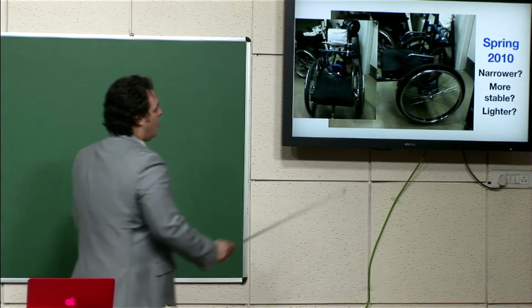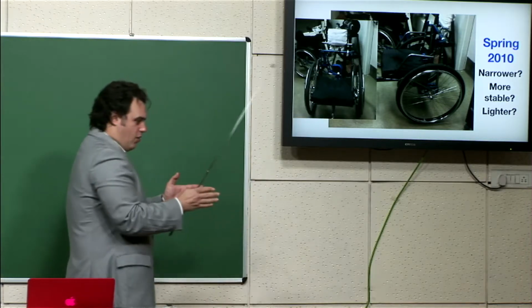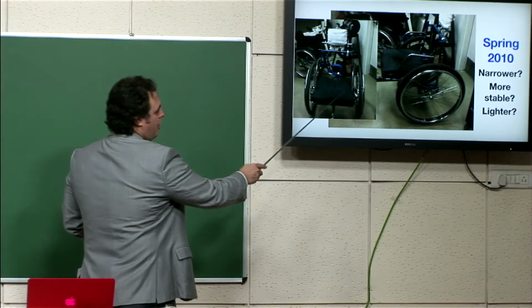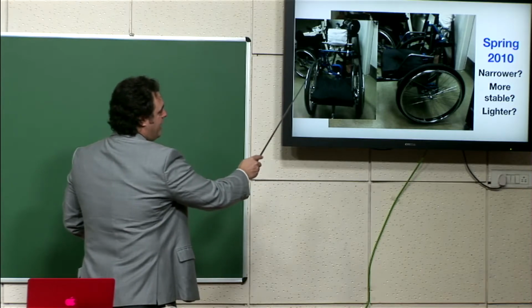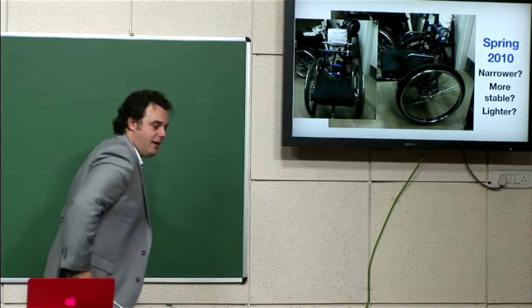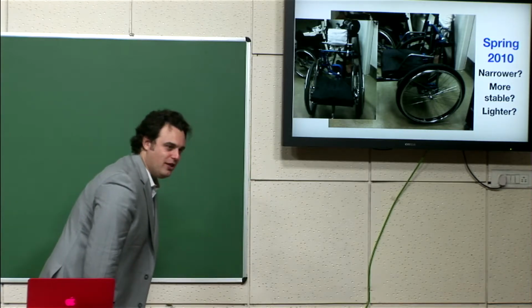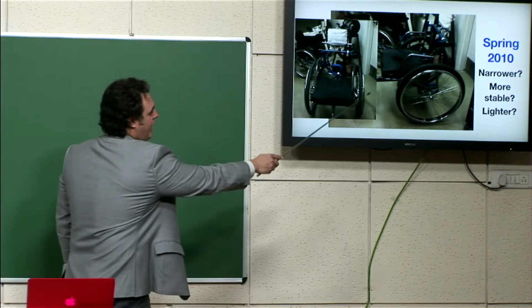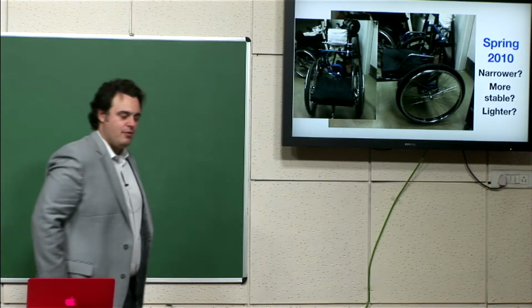And so this is a very rudimentary prototype that's showing 2, I'd say, critical innovations that we created. The first is we went to a narrower tire size, which made the overall wheel narrower. We set the bearings inwards on the chair a little bit, but to leave room for the lever, we actually made the armrests start from the outside of the seat back, where you're wider at your hips, and taper inwards to the front of the seat, where your body's narrower at your legs. So this allowed room for the lever to swing and allow for the wheels to come in. Even though we made a narrower chair, we still had room for our hips.